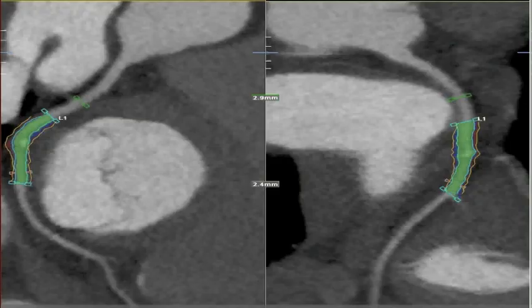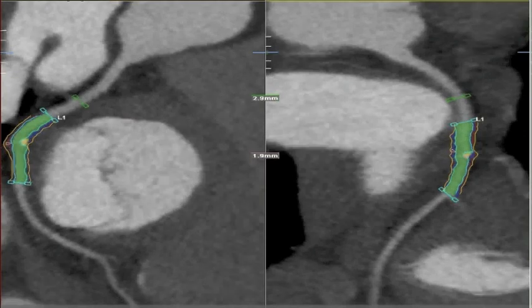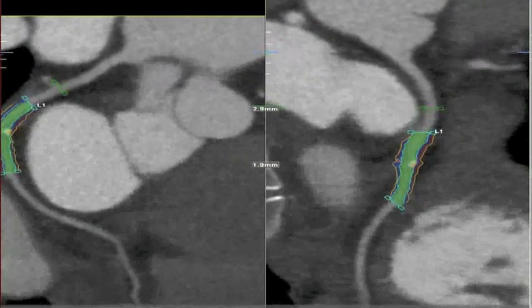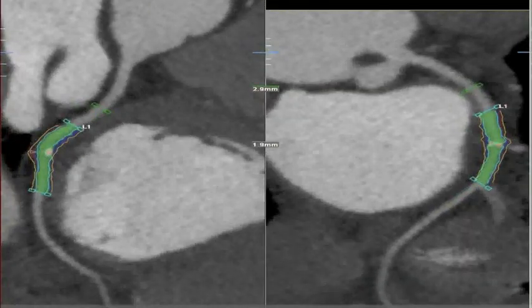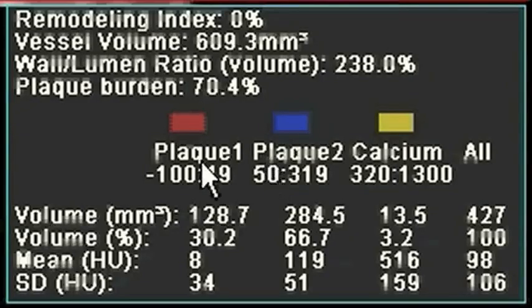Having a look at the effect in the circumflex — previously it didn't pick up the calcium — once we change the setting, the contours are much more accurate. Again, we can scroll through to make sure that the boundaries are correct and that no contrast has been included within the measurement. Looking at the volume of calcium, we see that it's 13.5 cubic millimeters.